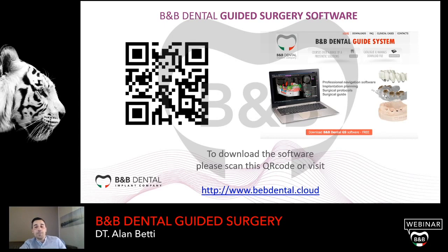The software works through your mail, and you can share all your projects with whomever you want through the cloud. You only have to buy the exportation, 20 euros per exportation, by credit card, and you are ready to work and make guided surgery with our software.